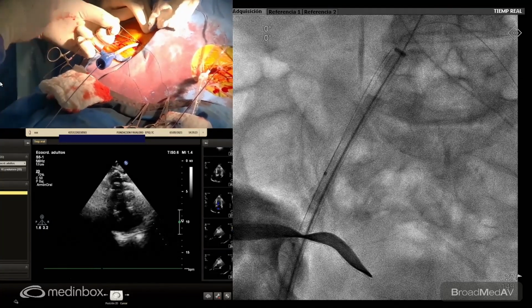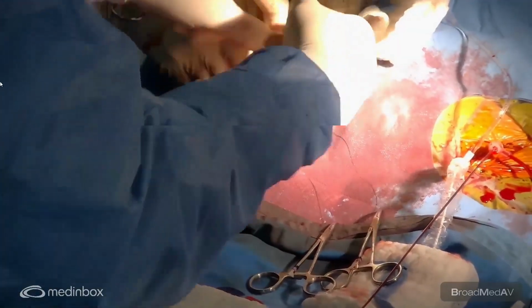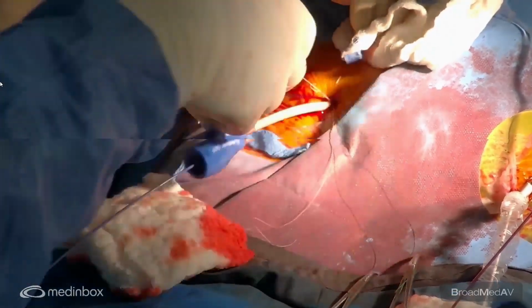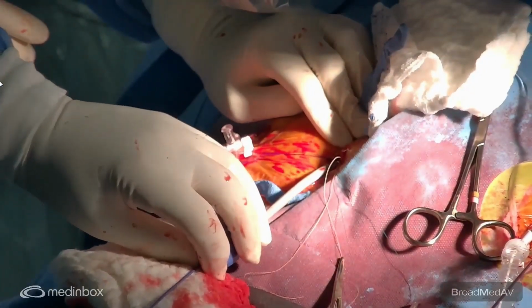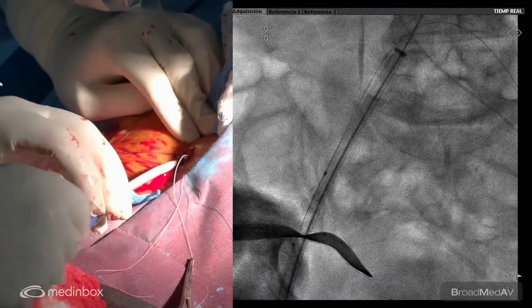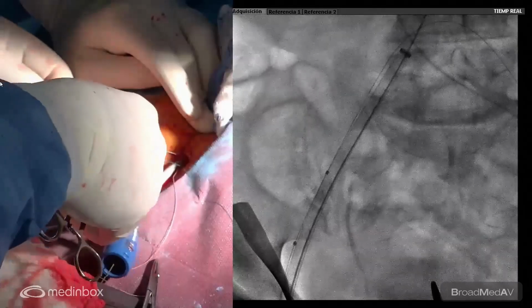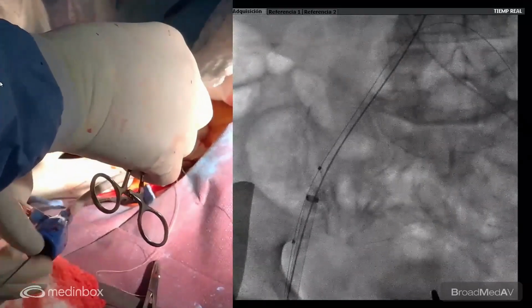Carlos is going to hold it, and Dr. Jaime is going to reverse the heparinization. Yeah, pull those. It's okay. Let's go. Excuse me. We have something here inside, which is the pigtail. Leave the wire and pull the pigtail. Okay, just in case we need to introduce something else. So Dr. Fava now is going to pull the sheath. Meanwhile, I'm going to close the suture.